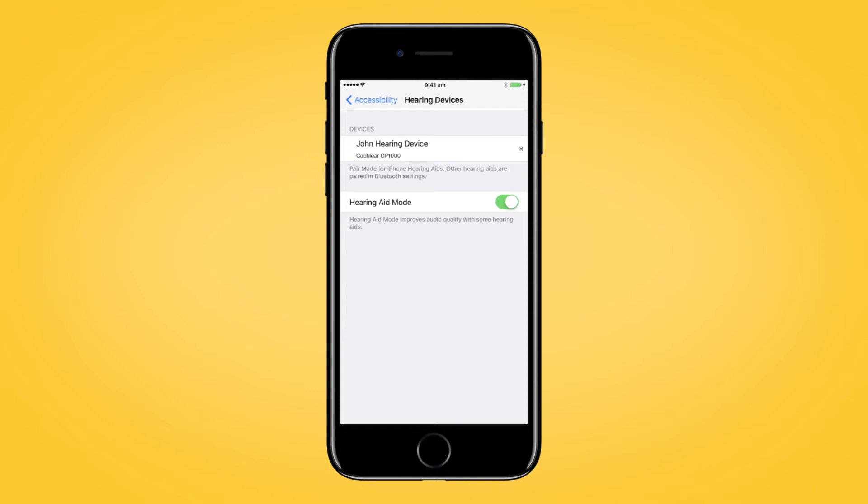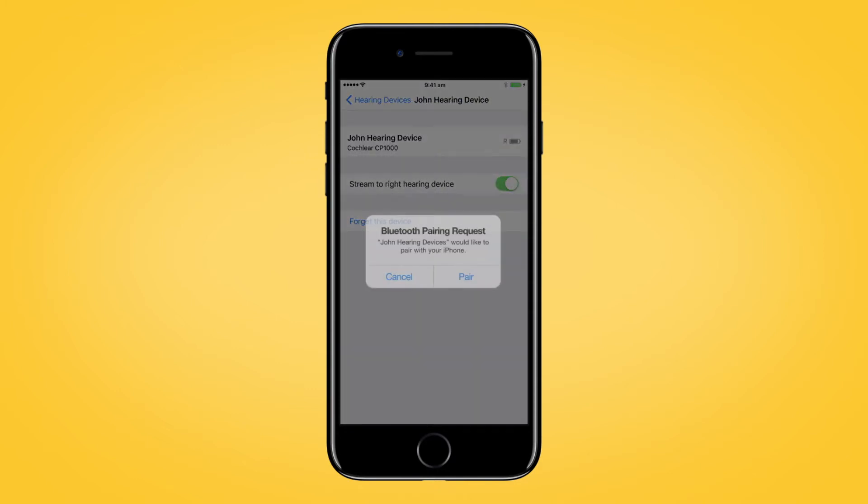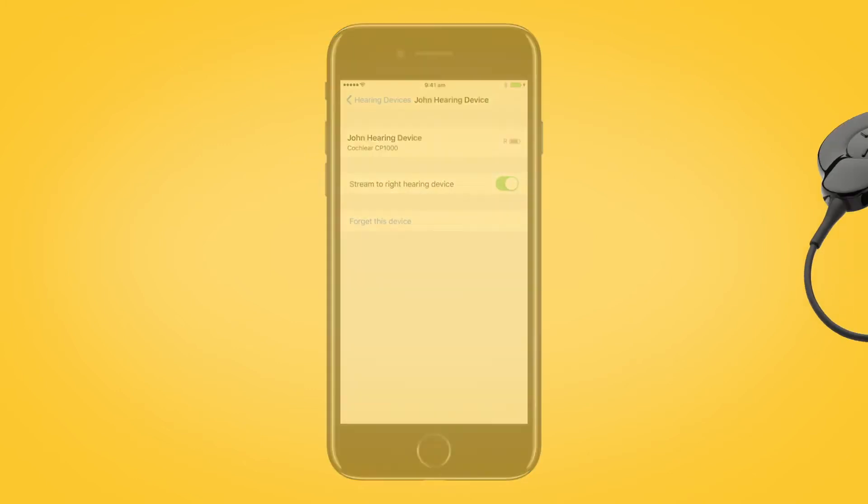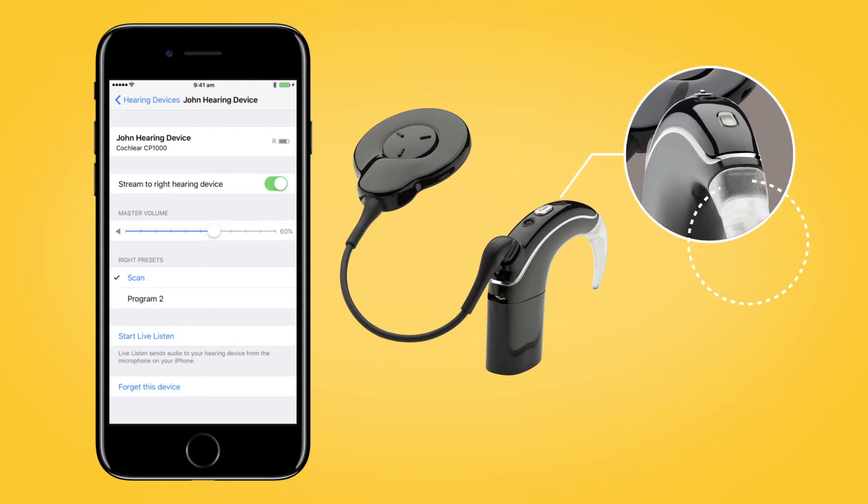Select the name of your processor and tap Pair. You will hear six beeps to indicate that pairing has started. The sound processor light will flash blue for four seconds.